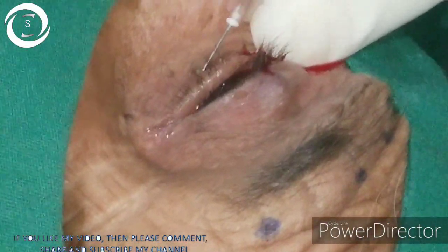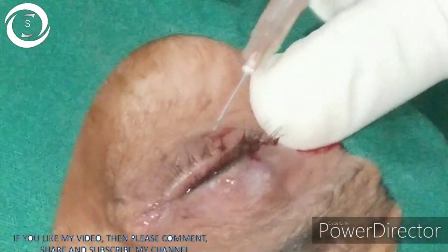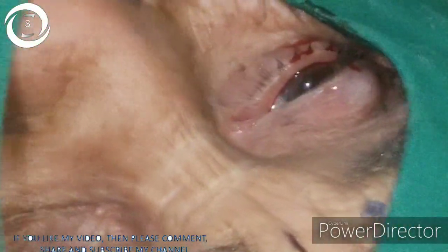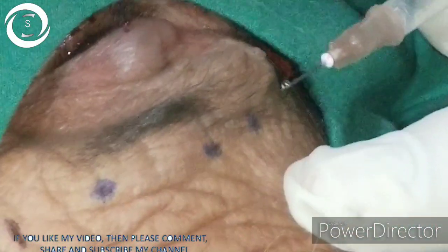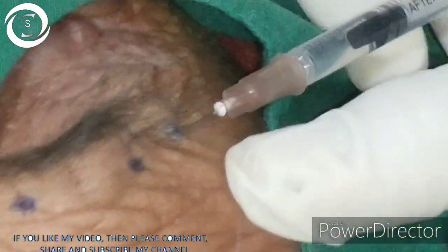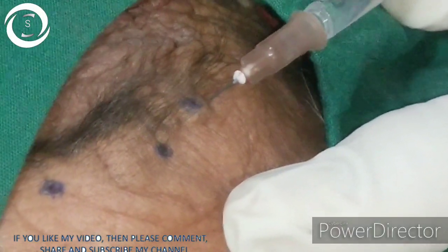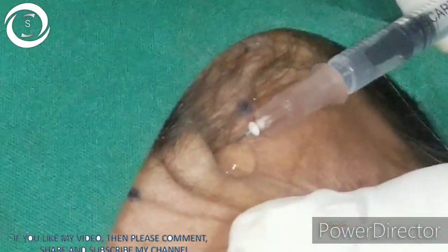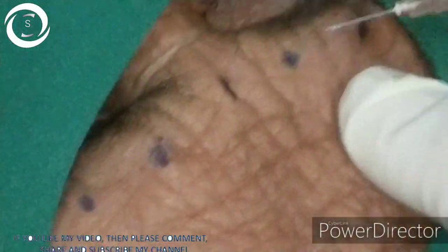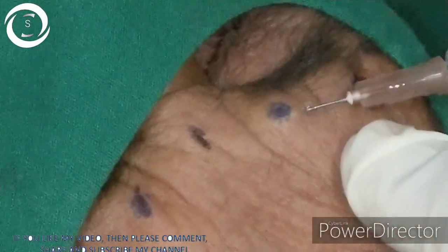As you can see, I am injecting and the solution is just beneath the skin. Some doctors try to press the injection site hard and spread the injected solution with alcohol-soaked cotton swabs. It is better not to do that — if blood comes out, very gently mop it, because the botulinum molecule is very fragile and even gentle pressure can break it and cause loss of efficacy. You can see I am injecting at the marked points and elevating the injection site with the solution.